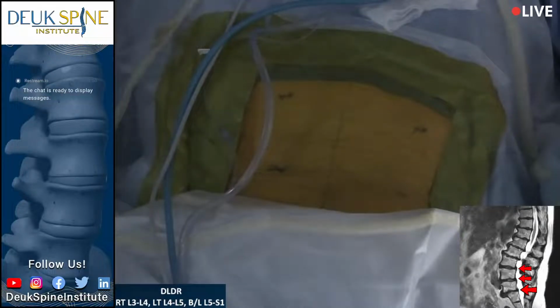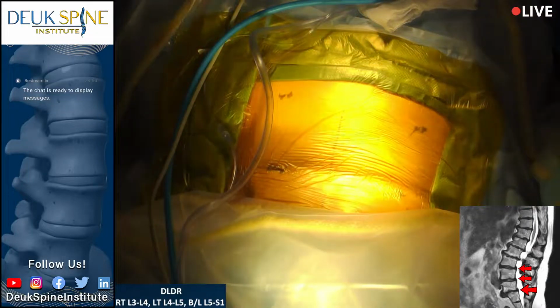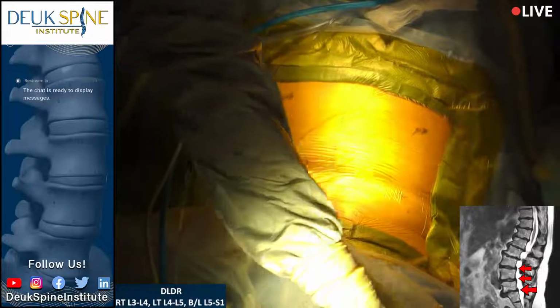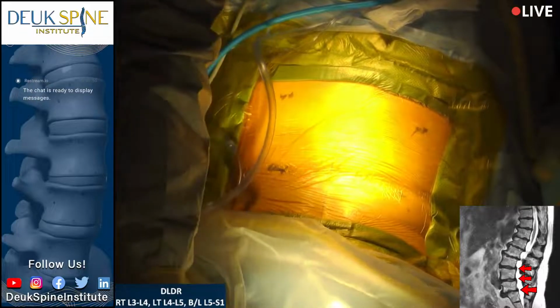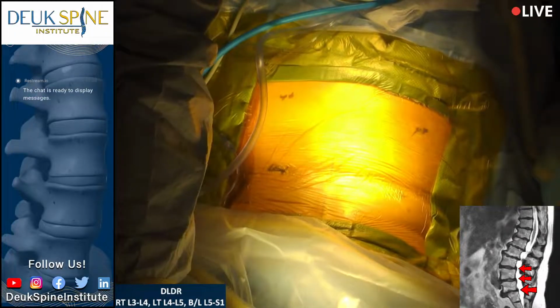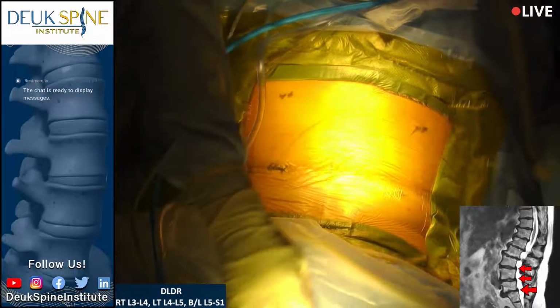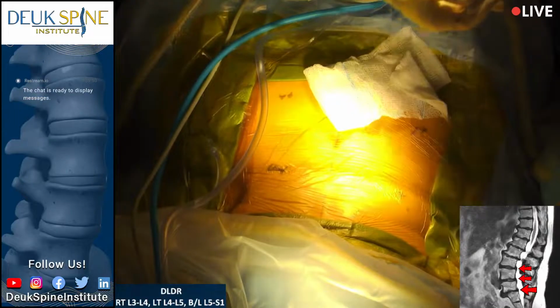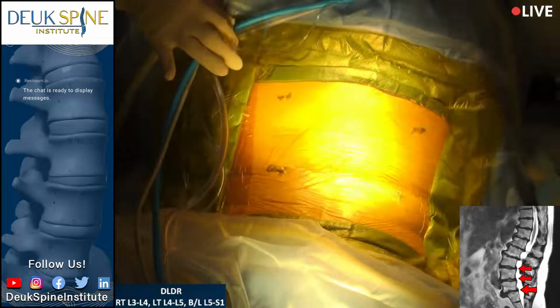All right. Very good. Let me see the MRI, please. So our patient is having pain in her back and legs from problems with her spine. Those problems include herniated disc, degenerated disc, slip disc, slip bone, spondylolisthesis, scoliosis, all kinds of stuff going on. But the back pain itself, we believe, is coming from 3 discs, which we're going to repair today.